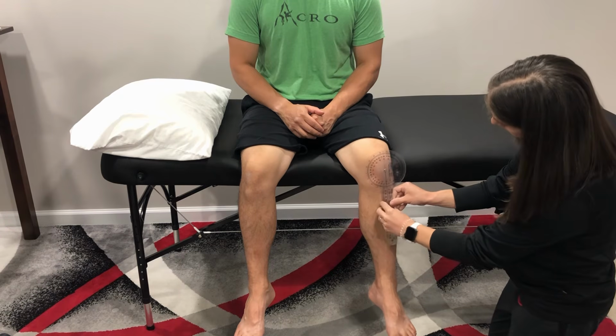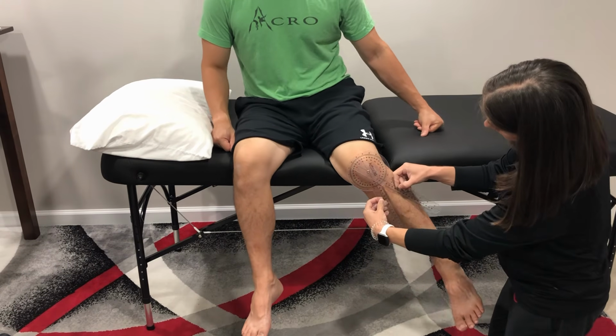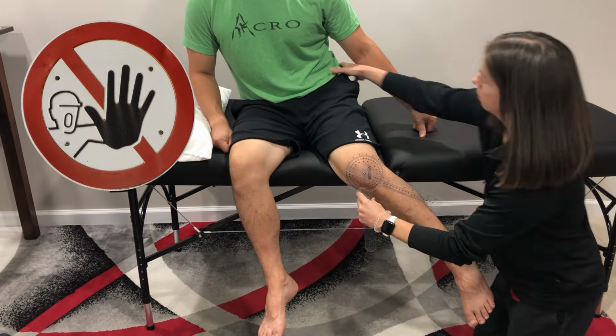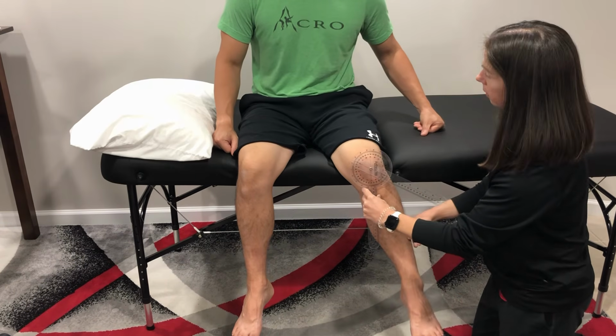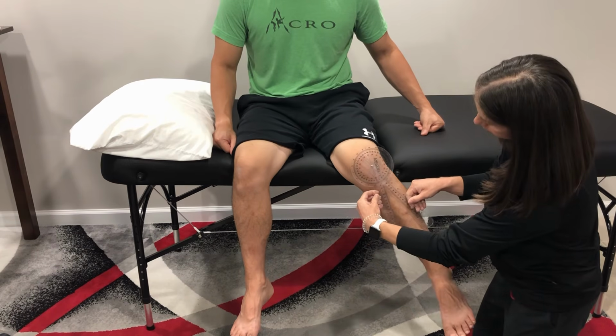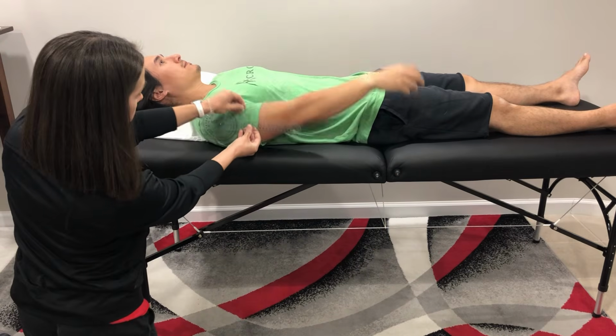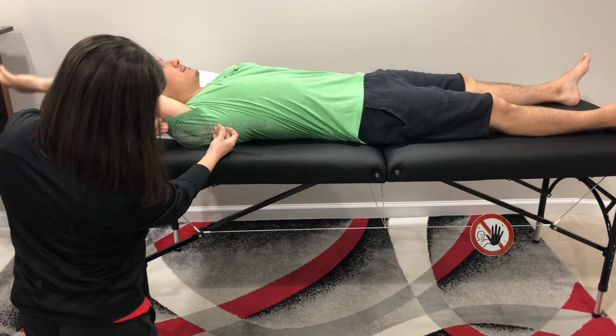During measurement, it's also important to keep an eye out for patients who unknowingly cheat to try and improve their range of motion. When first learning goniometry, it's important that you don't focus so much on getting your measurement that you fail to identify compensations on the part of the patient and correct them. Failure to identify and correct these compensations will result in measurements that are not reliable.